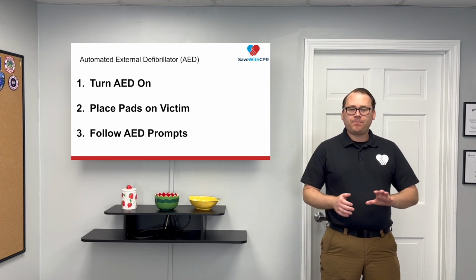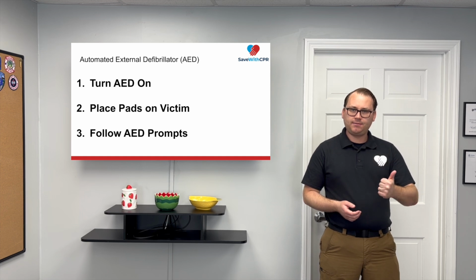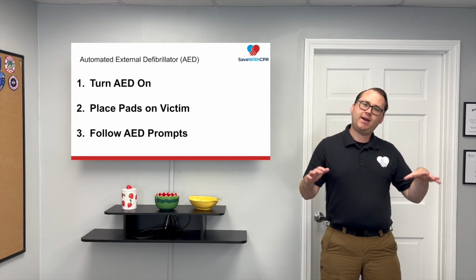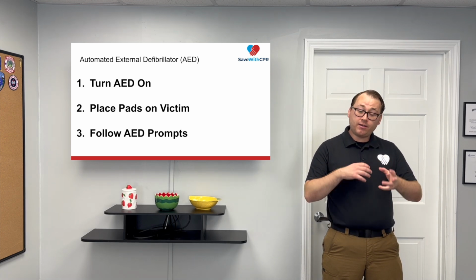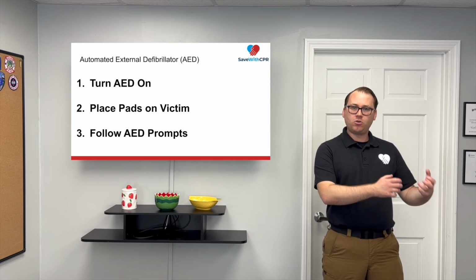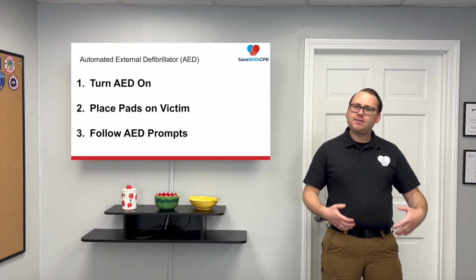So an AED, you open it, you need 3 steps. Turn on the AED, place the pads on the victim, and just do what it says. Right? And so when you power on this AED and put the pads on the patient, the AED is able to analyze or interpret the electrical signal of the heart. And it's able to determine, is this a normal electrical rhythm? Is this abnormal? And if it's abnormal, does it need to be reset?